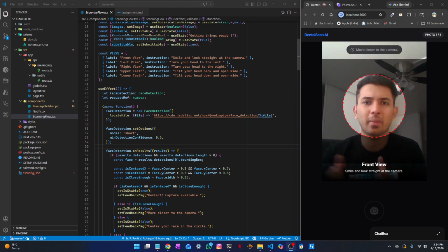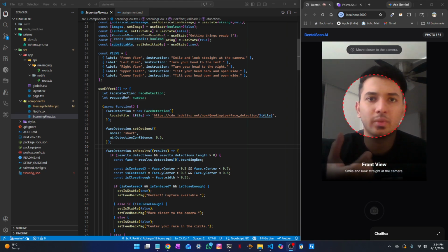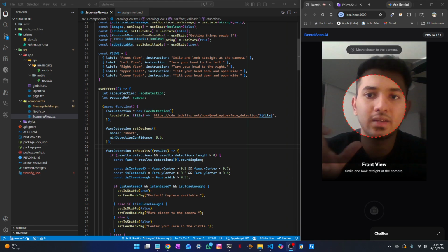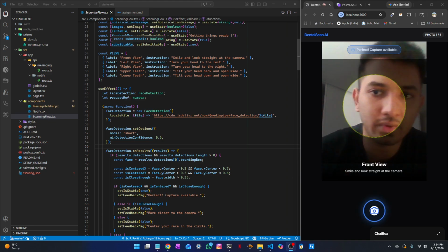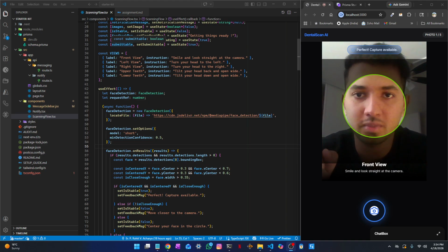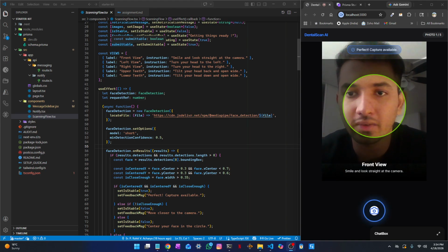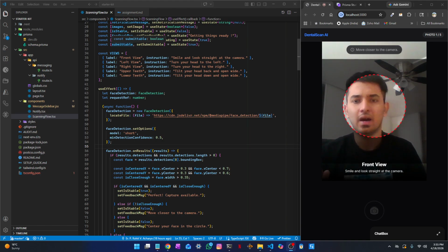So for this I've set the parameters like x center to be 0.3 to 0.7 and the y center to be 0.3 to 0.6, and I've used the face width to be around 35% just to make sure that the user's profile is completely filled in this circle, and then only the color will be changed to green. Else there will be a message here that will notify the user to come a little closer, and when the user is perfectly aligned into the frame, then only this message, perfect, capture available, will be visible, and then only the shutter button, if you observe here, will be activated. Else the shutter button won't be activated, and it won't allow the user to click random pictures.